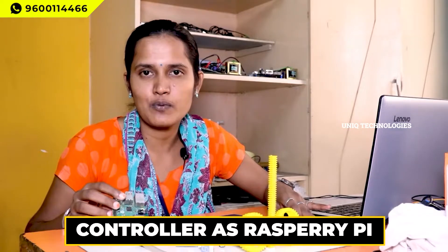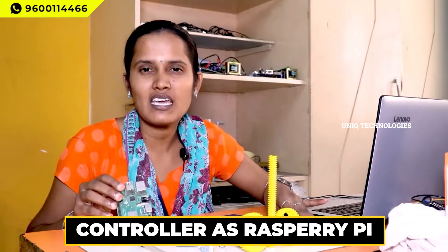These are the components used in the wheelchair as well as the kit. We are using the controller as Raspberry Pi — this is a Raspberry Pi 3B Plus model. This is the controller we used, and this is a keypad, which the person uses to give input.